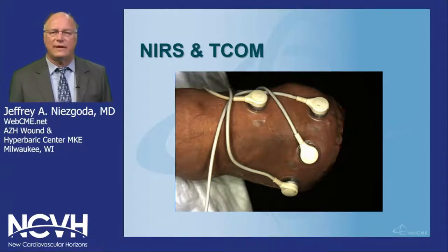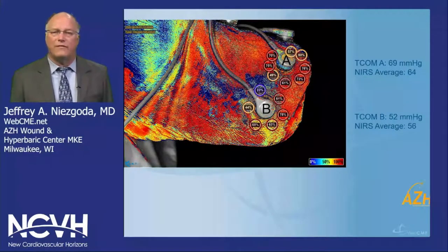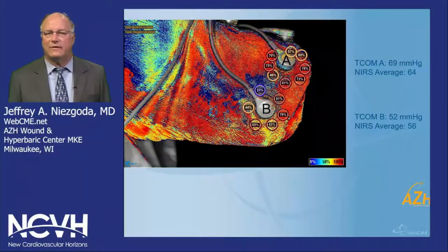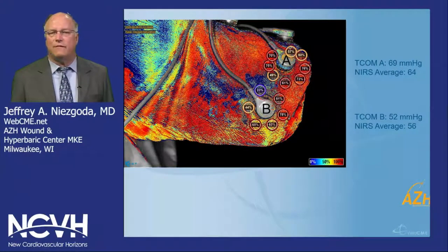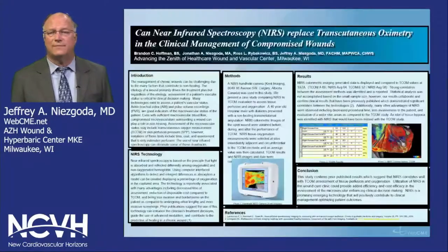We also have decided we can use SnapshotNIR to evaluate patients when all we had before was transcutaneous oximetry. As you know, there are many challenges with transcutaneous oximetry. This has been the mainstay treatment in guiding some surgical decisions as well as predicting wound healing. And we have done some evaluation, as have others, where we've compared transcutaneous oximetry values to that obtained with Snapshot. The correlation is very tight, and I think that this is going to be much more efficient in getting data to determine tissue oxygen saturations as opposed to the old TCOMs.